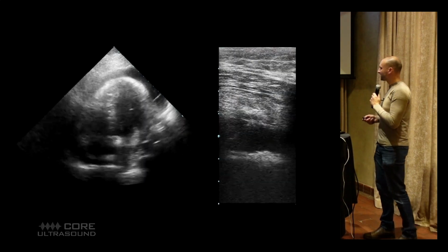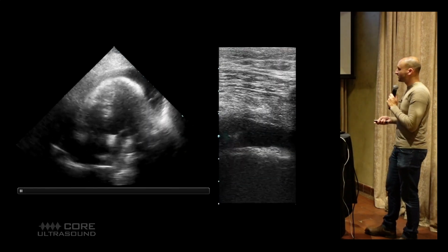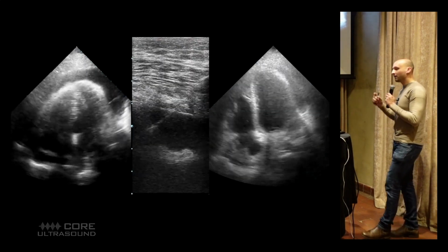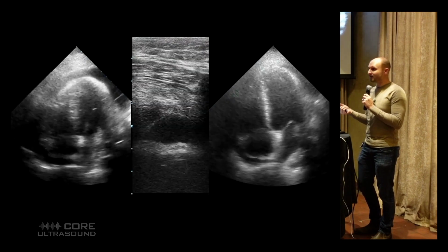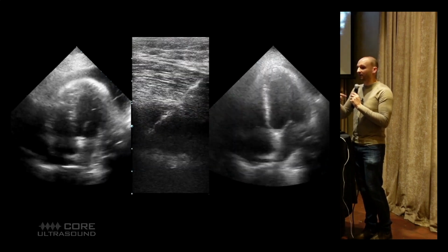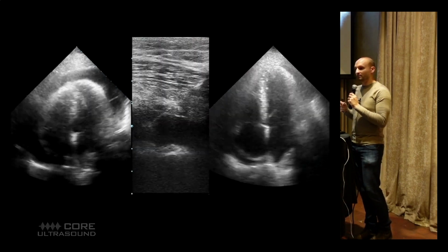Here's a patient that had a pretty big effusion. Here's a linear transducer, that guidewire going right into there to drain that effusion. And then right here, you have the post image, a lot better, right? If you have a pericardiocentesis kit, use that. If you don't happen to have that, just use a central line. A central line works really well, just leave it in there, and then you could drain it kind of PRN. If the patient reaccumulates, you already have that drain in there, you just drain it out until their blood pressure gets better, and then take your syringe out.